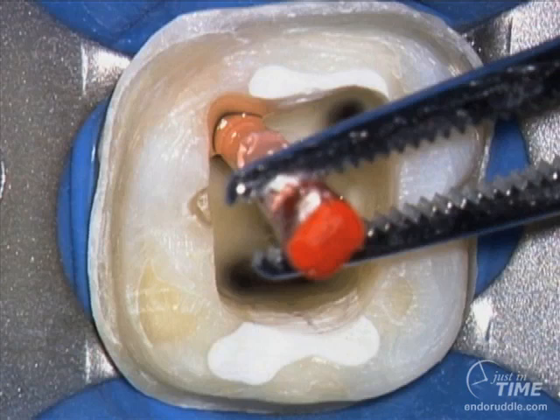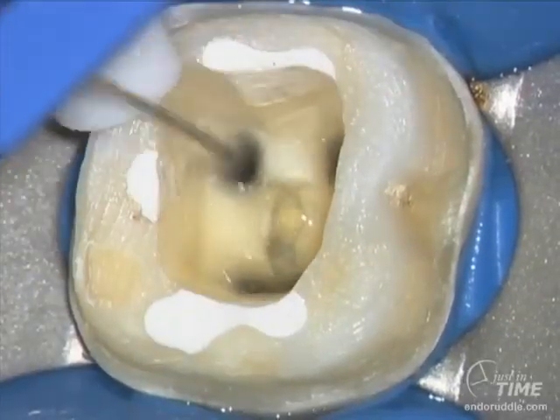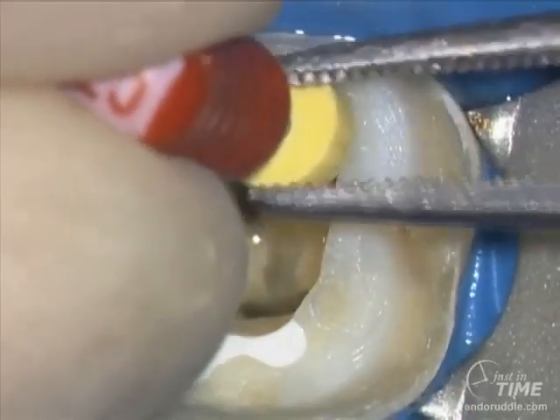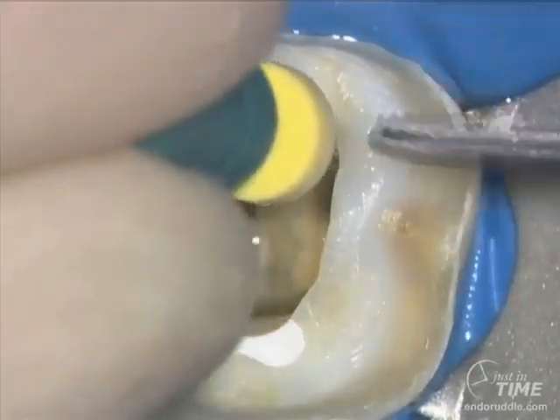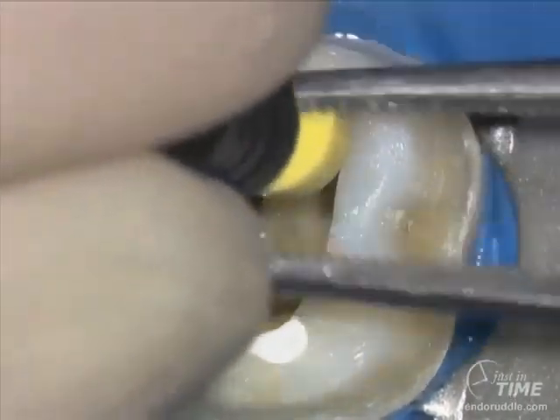I want to show you in the other mesial system something that might be quite interesting for you to see. Let's look. I shaped the MB and the ML together, and here's the gauging file that is at length and it's snug. Notice that each larger successive instrument will not move into the canal as deep. I'm simply having my rubber stop pushed down by the dental assistant, and I'm going through a series of files. I'm not working these instruments.